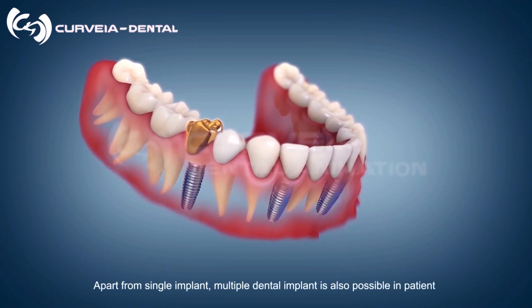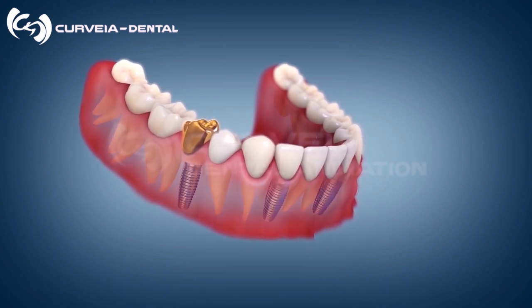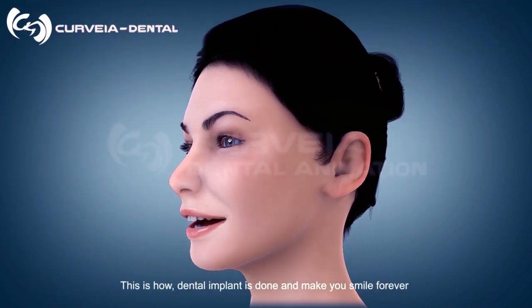Apart from a single implant, multiple dental implants are also possible for a patient. This is how a dental implant is done, and it can make you smile forever.